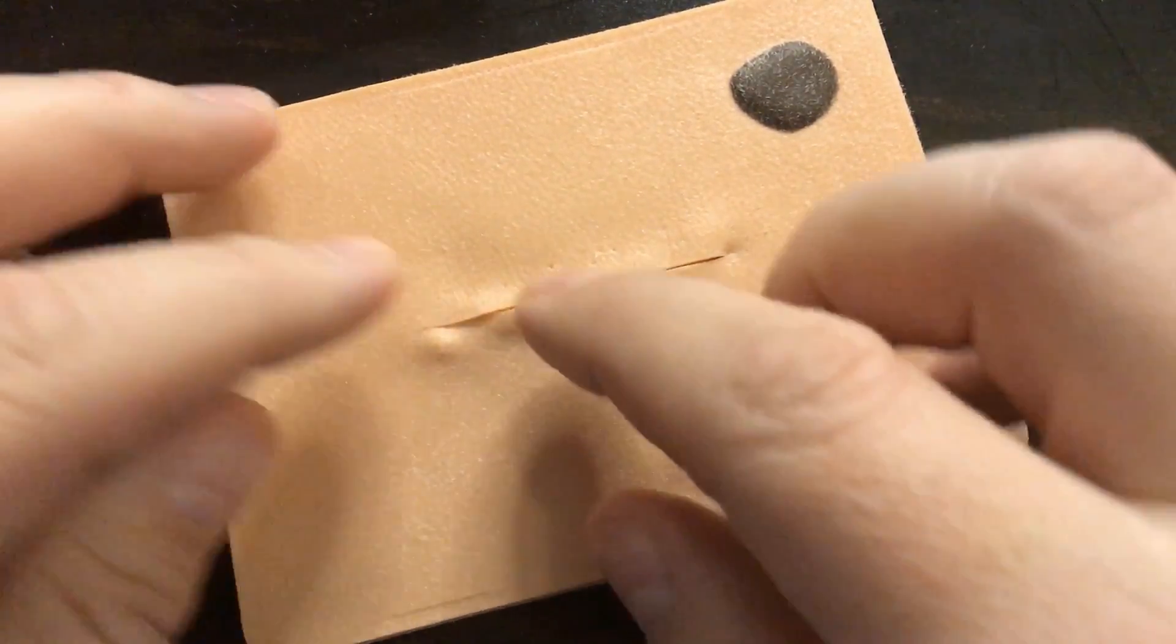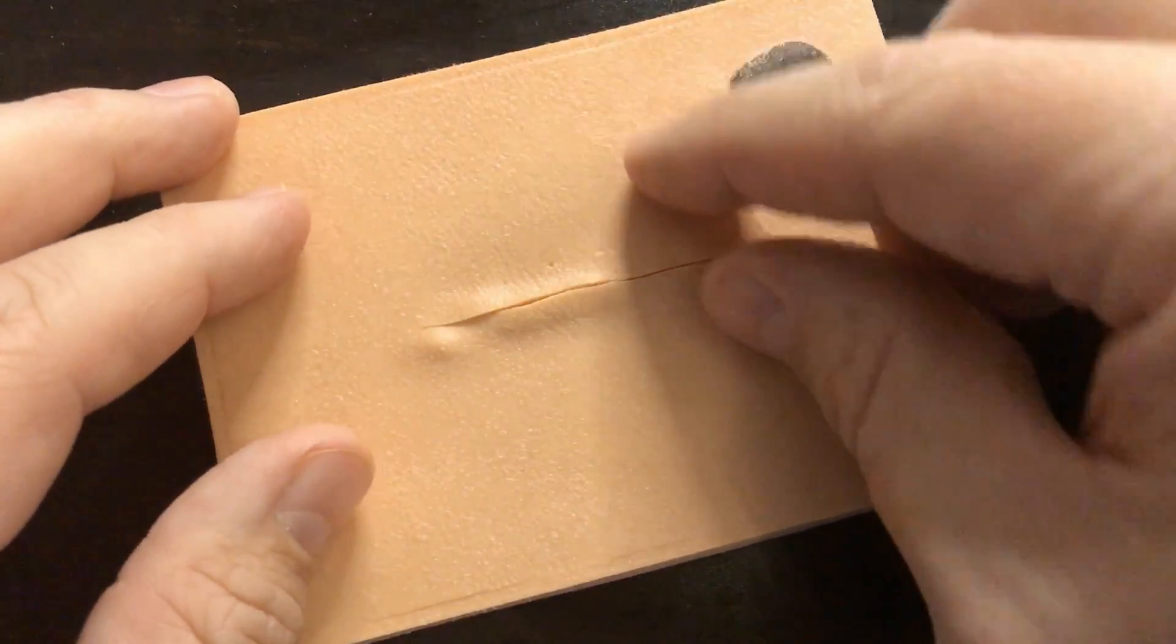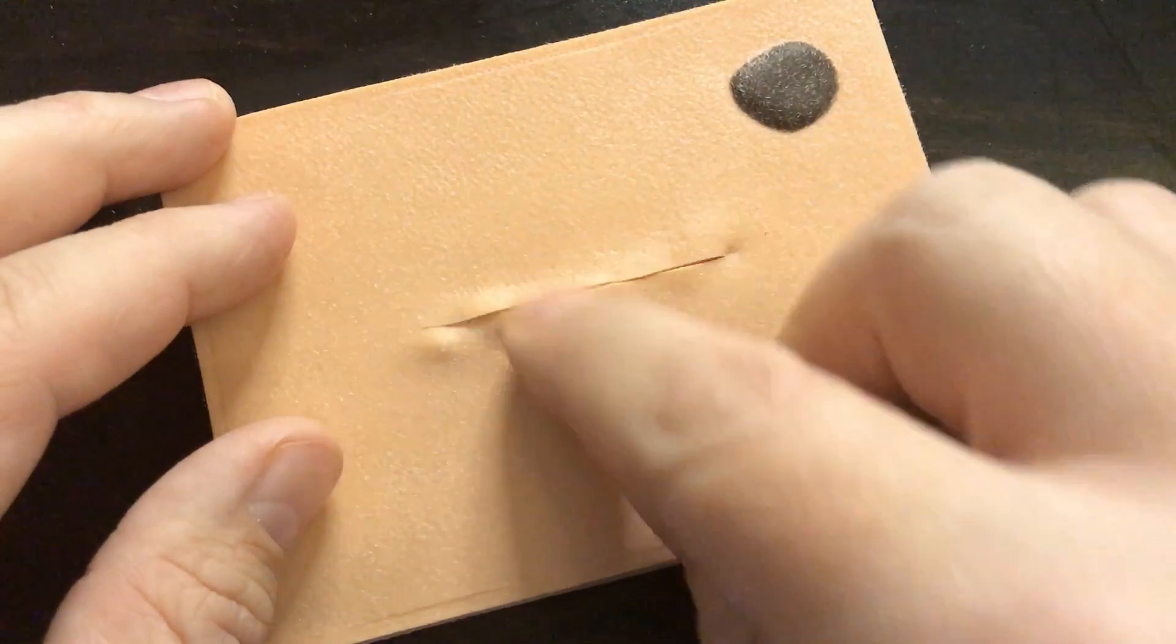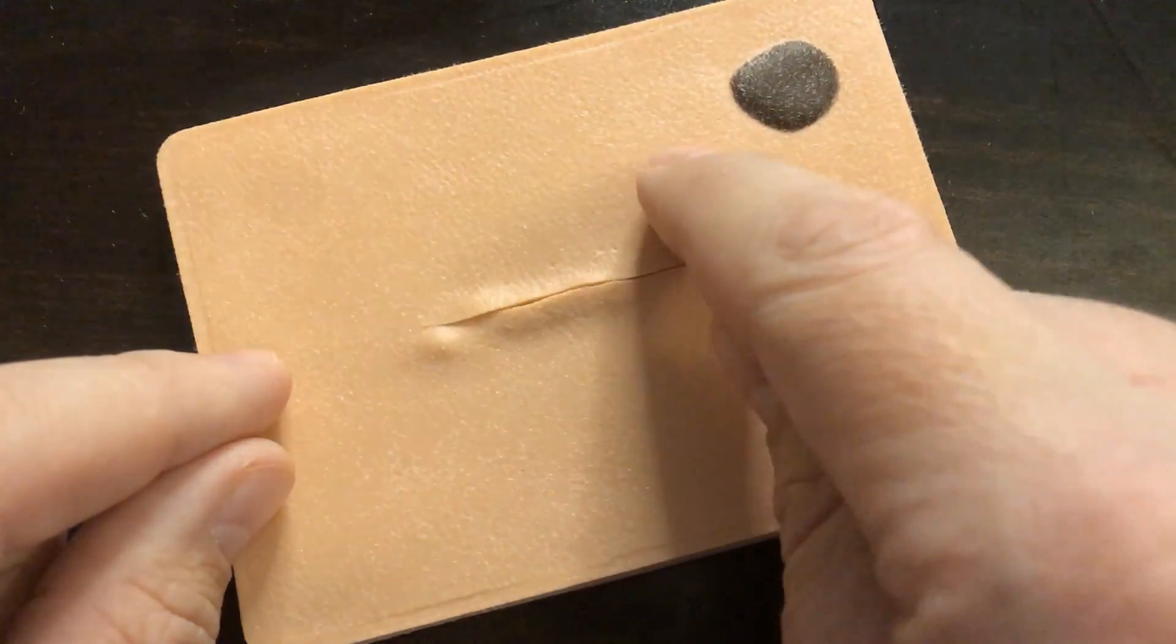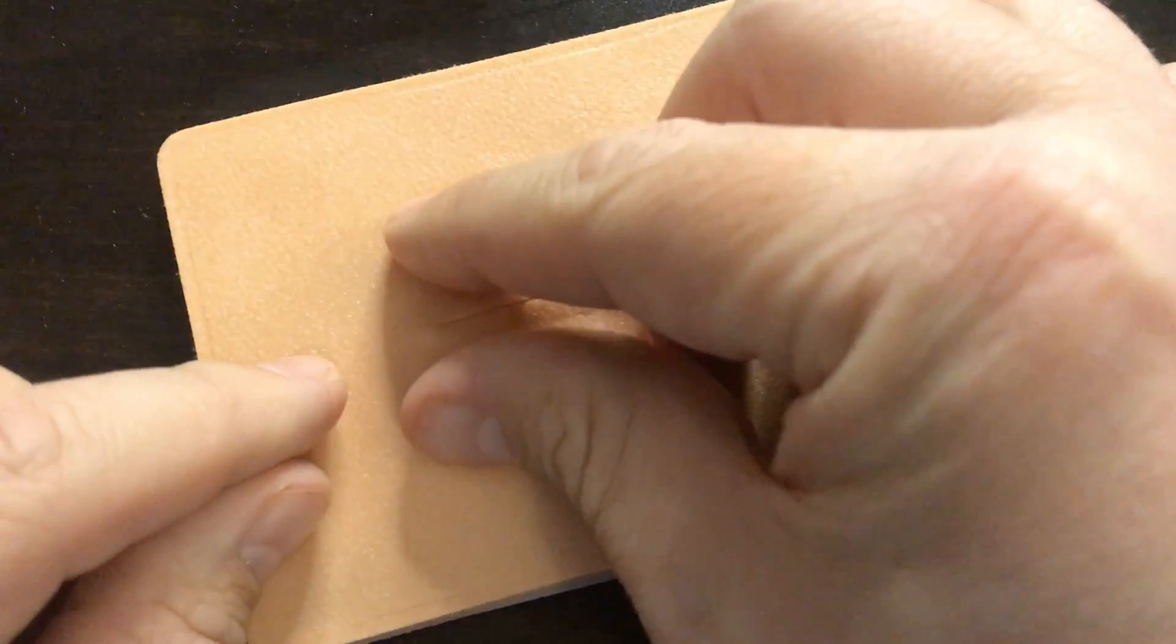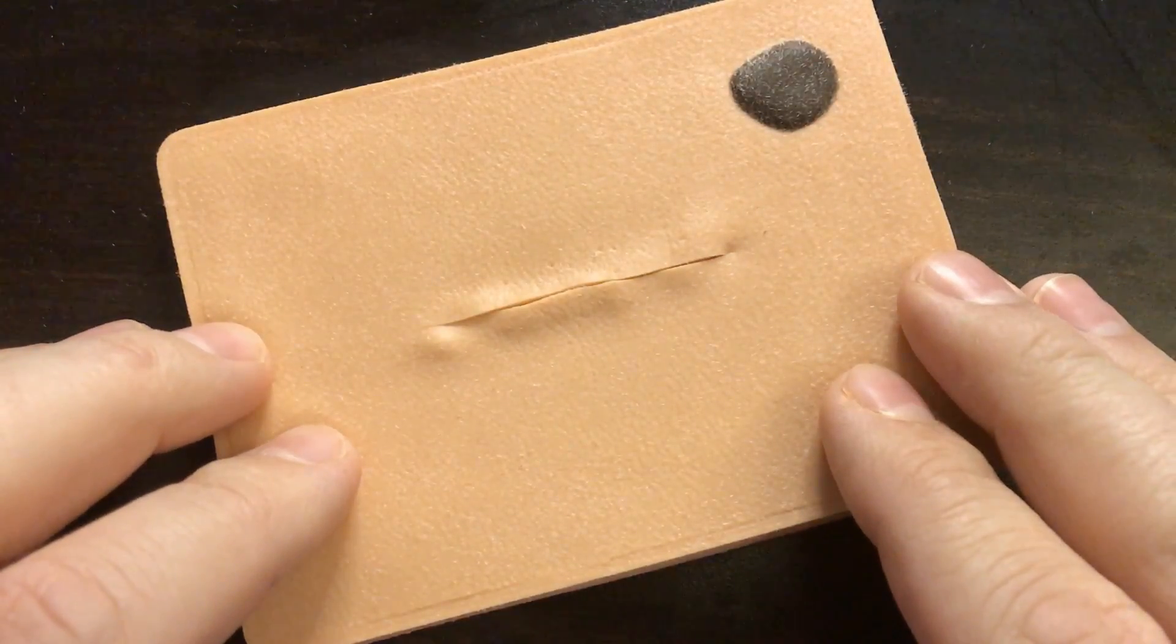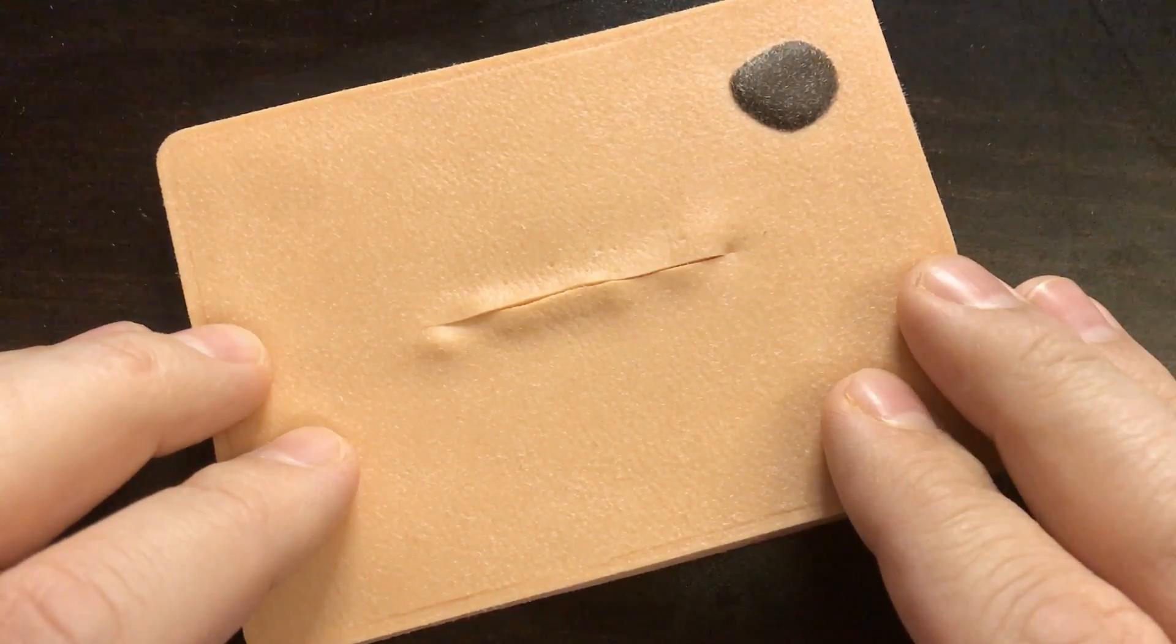That being said, after placing a subcuticular running suture like this that is not very strong, I usually am going to place Steri-Strips using some mastisol glue out here on the sides and then Steri-Strips across to give it a little bit more reinforcement so that it heals well and let those Steri-Strips fall off on their own over the next seven to ten days and you are good to go.